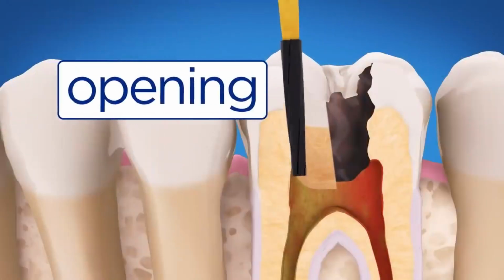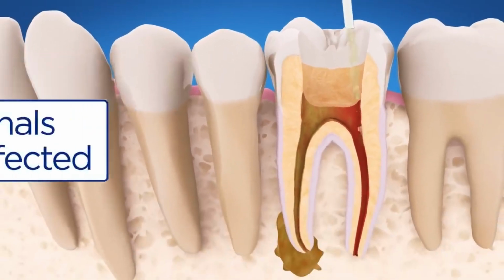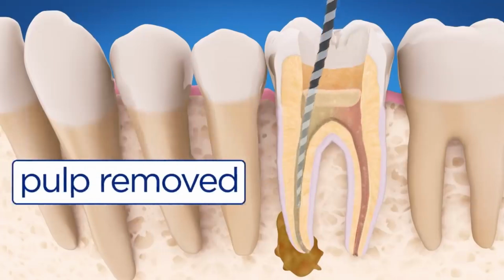First, your endodontist will numb the tooth so that you won't feel anything during the procedure. An opening is made through the crown of the tooth and into the pulp chamber. Fluid is put in the canals to kill any bacteria and help rinse out debris. Then, the pulp is removed.